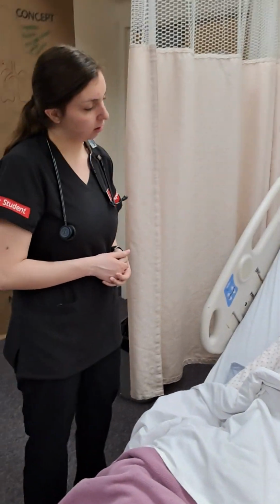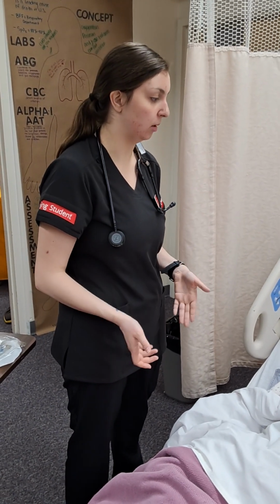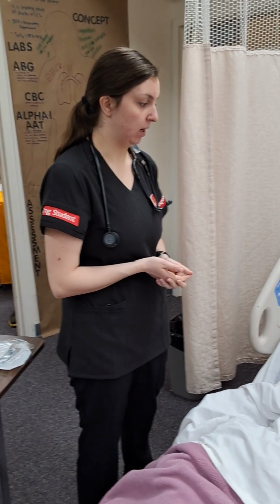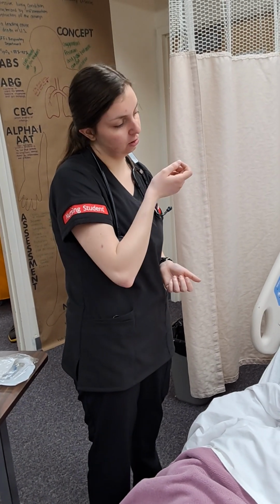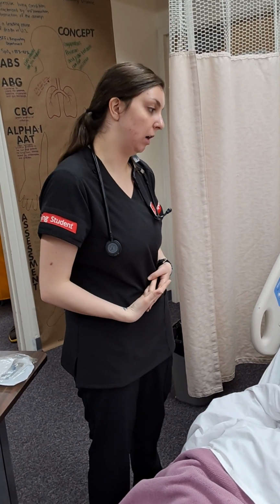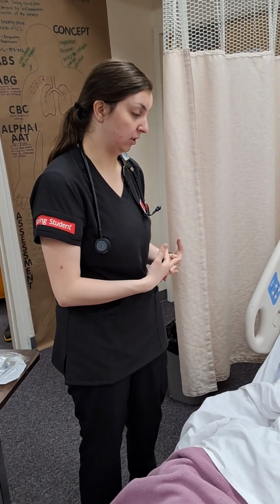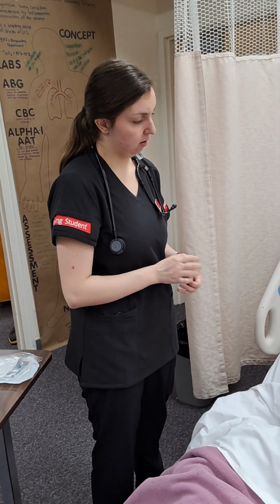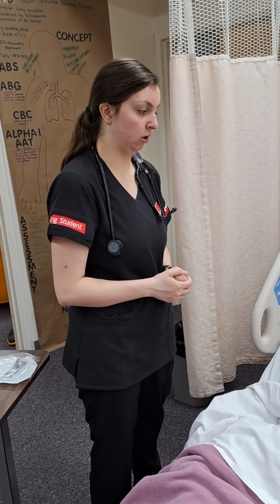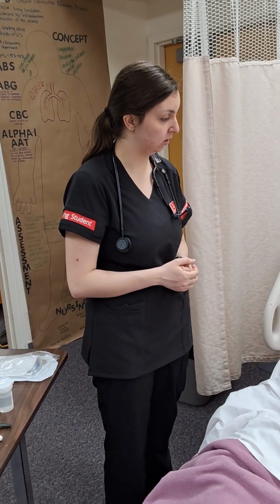Okay, so your doctor has ordered an NG tube to be put in. It's going to help decompress your stomach. NG tube stands for nasogastric tube, and it's going to go in through your nose, down your throat, and into your stomach. We're going to hook it up to suction once you get back from x-ray, and that'll just decompress your stomach. This procedure is not supposed to hurt, but if it does, raise your left hand and I will stop. Do you have any questions?